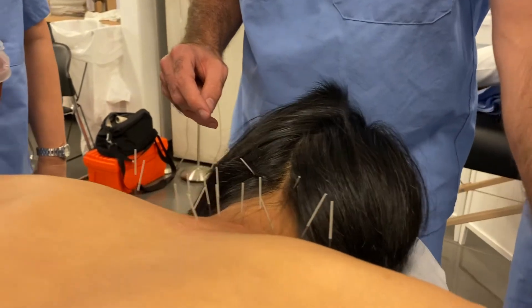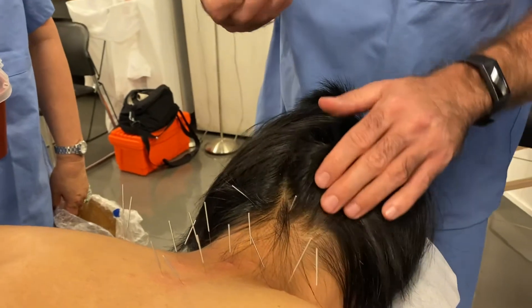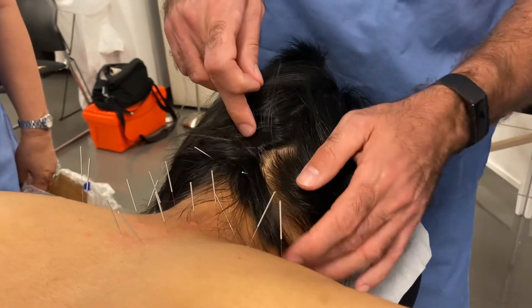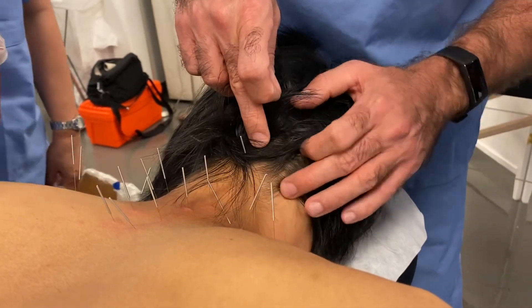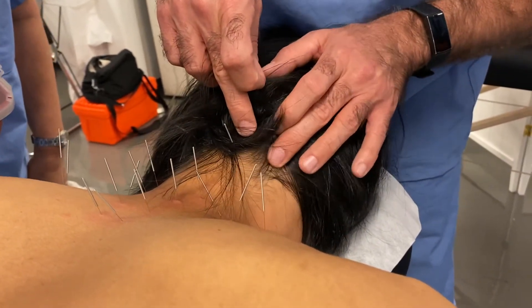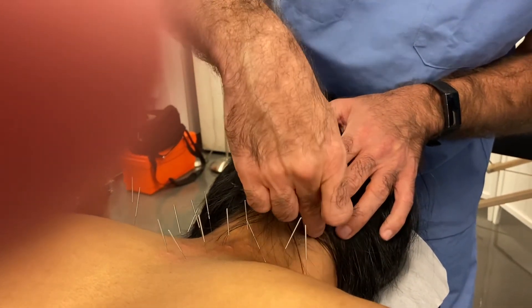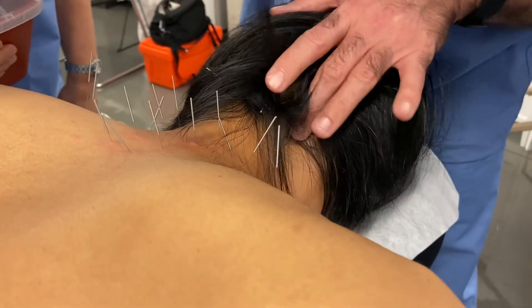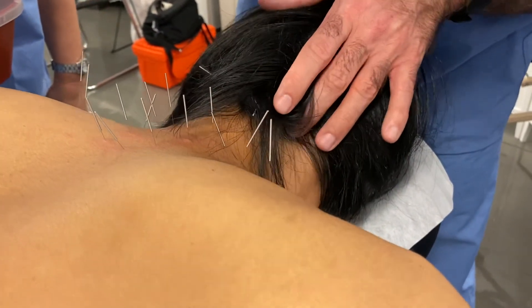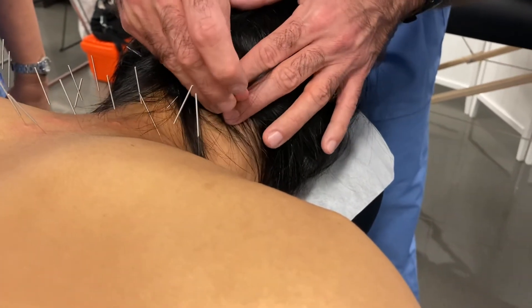And then Gallbladder 20 — we're gonna aim it towards Michael's nose if we can imagine where that is. I find the SCM and the trapezius; it's in the pocket between the two. You'll see how the trapezius comes up here and the SCM comes down there — there's a little river in between those two mountains. I can feel both sides in this depression. This is where we're looking for a depression, like an acupoint, and then I'm gonna go towards his nose.